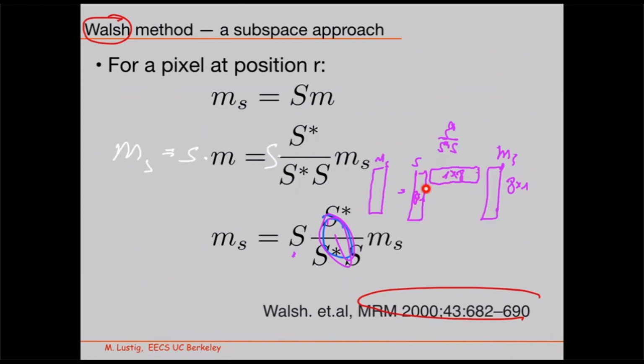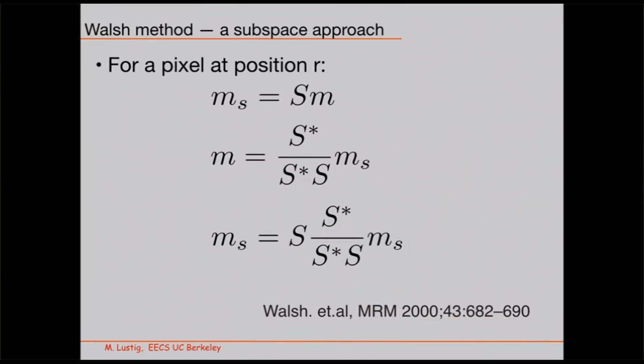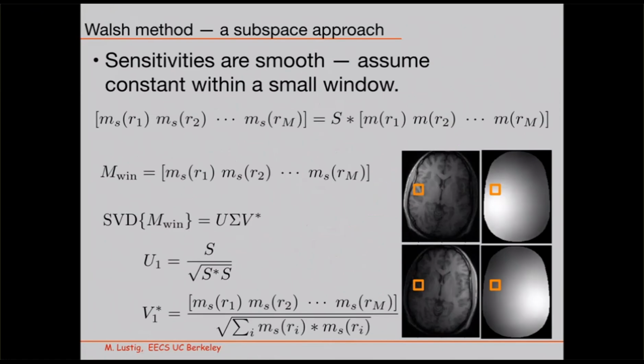A rank 1 matrix, basically these coil vectors live in a one-dimensional space, because I can combine it into one value and then expand it again, and I didn't lose any information. So although you have 8 values, it lives in a one-dimensional space. Does that make sense? Okay, so the idea there is effectively to estimate that subspace.